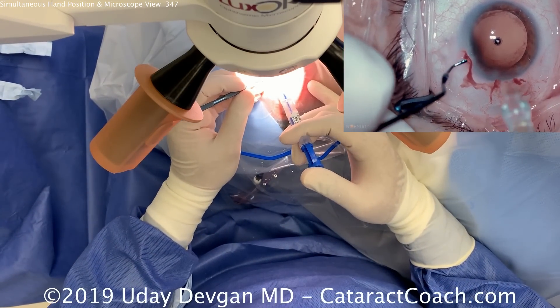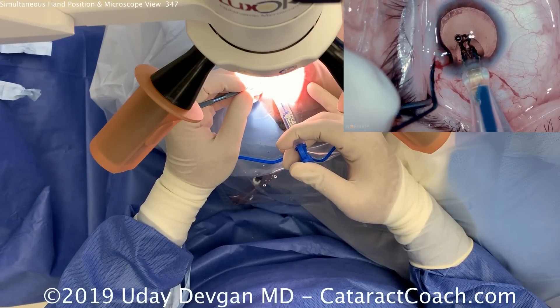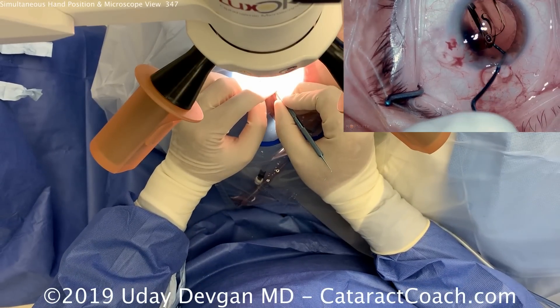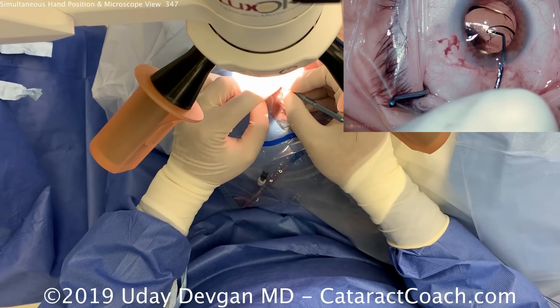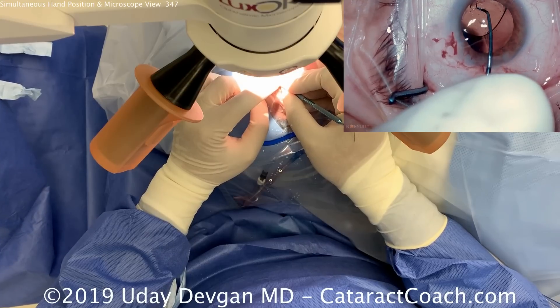Notice how the technician is right there ready to hand me the lens and instruments — this is a very experienced technician. Right hand holding the injector and on the plunger as well, left hand helping to fixate the eye. Now using the chopper in the right hand to position the IOL. We'll make sure the haptics open up. Everything looks great.